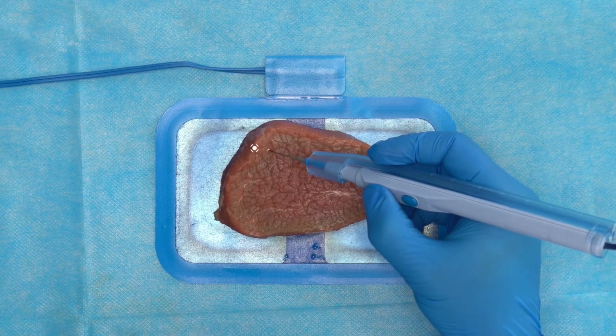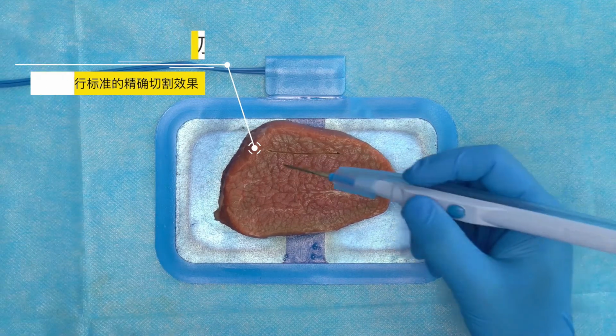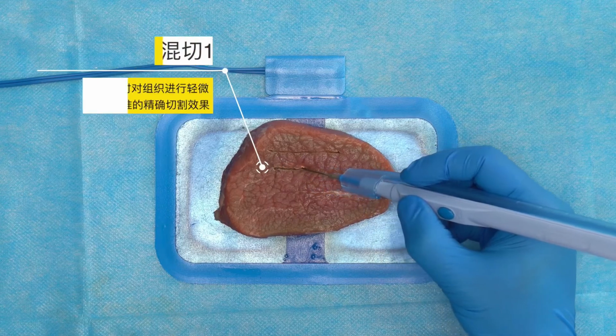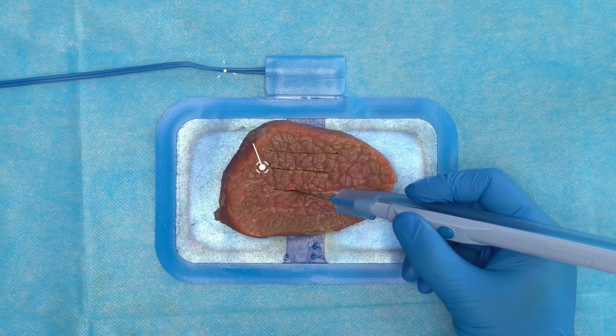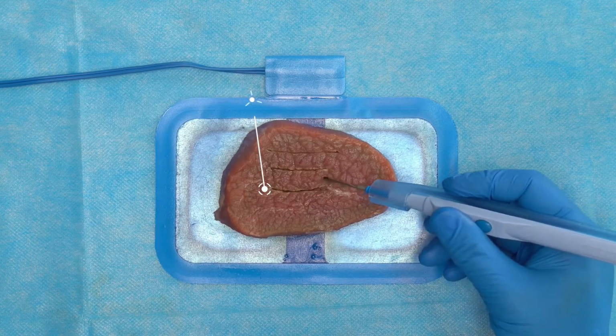Pure cutting mode can perform standard and precise cutting effects on the tissue. Blend cutting 1 mode can coagulate the tissue to a slight degree while cutting accurately. Blend cutting 2 mode can perform a further degree of coagulation on the tissue during cutting.